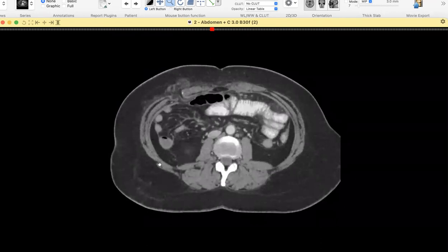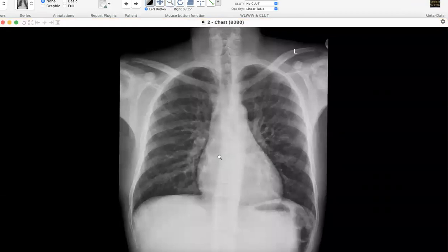Yeah. Okay, so we'll go to discussion. So overall, you did very well. Actually, I like your pace. I mean, you're not giving any fancy differential. You're going to the most common things.